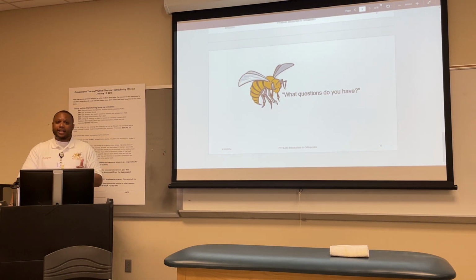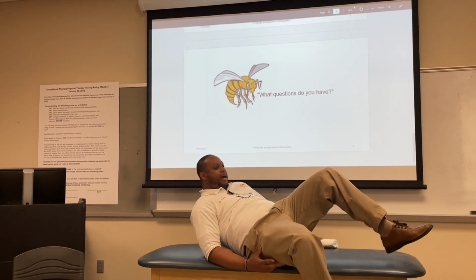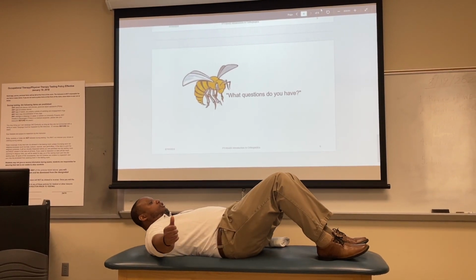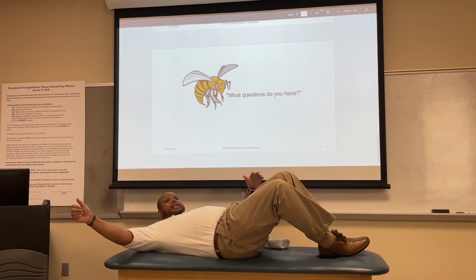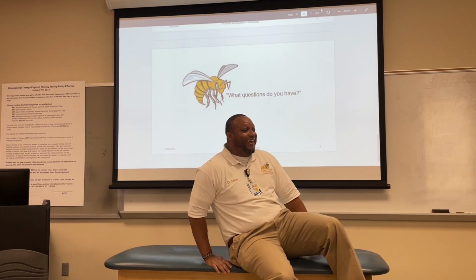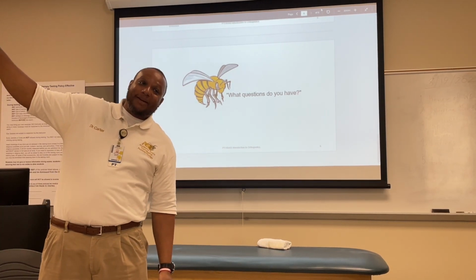So it may be that you can't stabilize because both of your hands are on the Goni. So now you're going to have to instruct them. For example, in the case of shoulder abduction, you get patients who do this. You say, let me see you do right shoulder abduction. They go. What are they doing? They're trying to get a couple more degrees with right shoulder abduction by trunk side bending to the left.